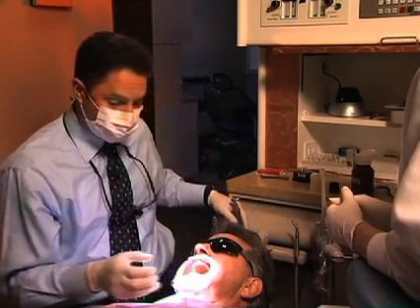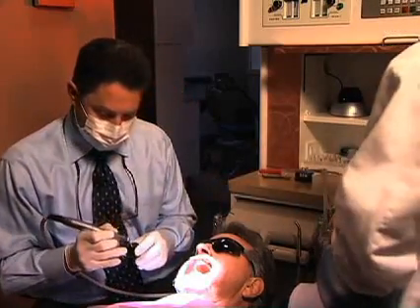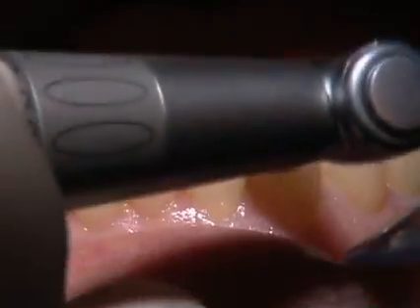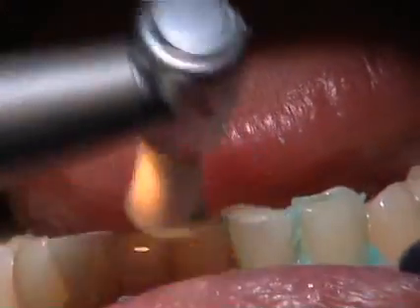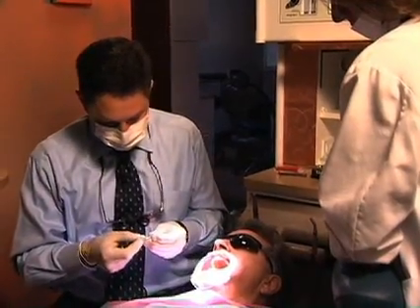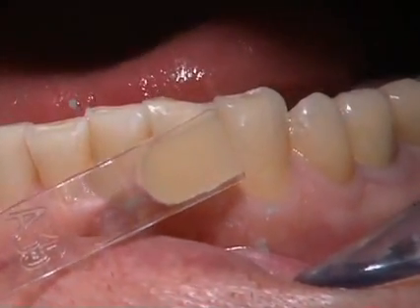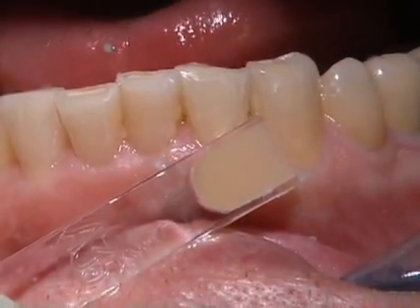Our first step is to go through and clean off the teeth — you can see there's a little bit of plaque on those teeth. We're going to take a little bit of Concepsis scrub from Ultradent, clean off the teeth and the plaque. Then for shade selection, we're going to match what we've determined to be an A3.5 using the Venus two-layer shaded guide template.